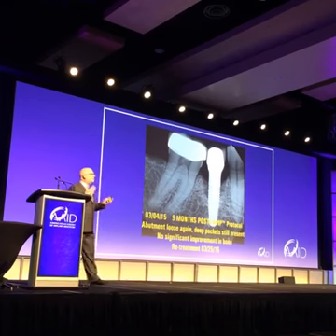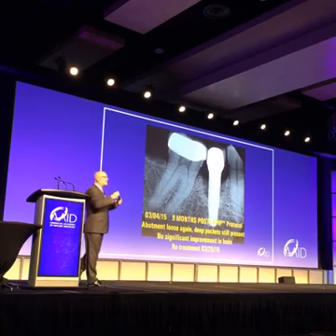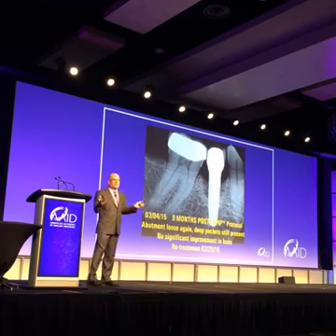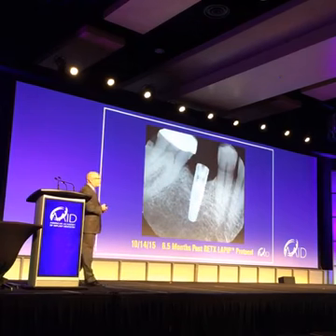But because I had done the LAPIP protocol, I still had the tissue there. I still had the original bone. I didn't lose any bone. I hadn't lost the implant, so I could retreat it. So we went ahead and retreated it.